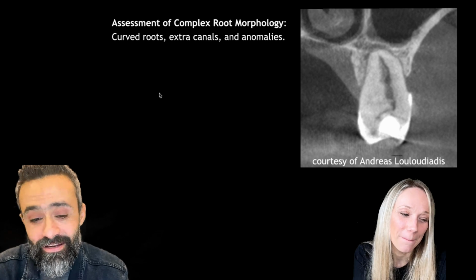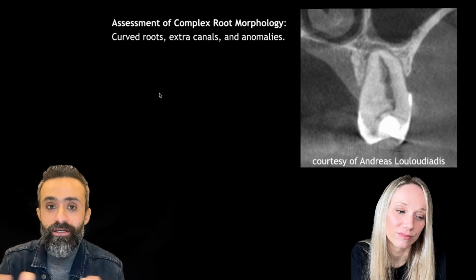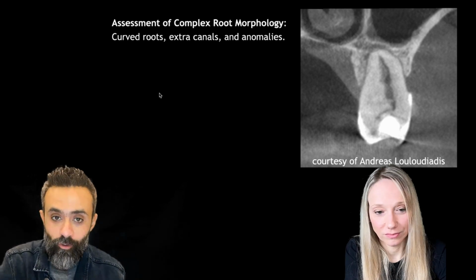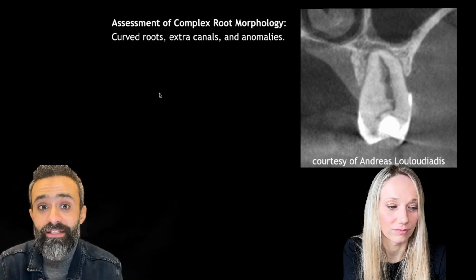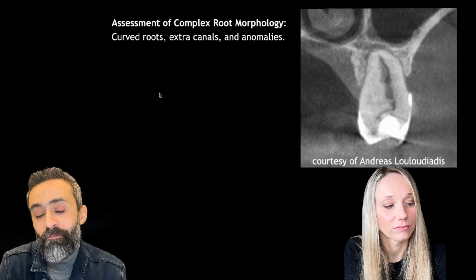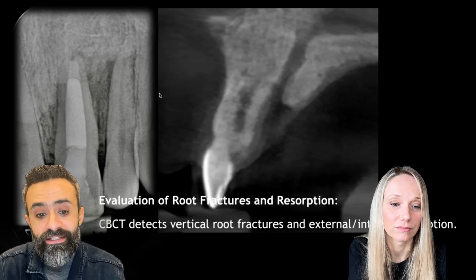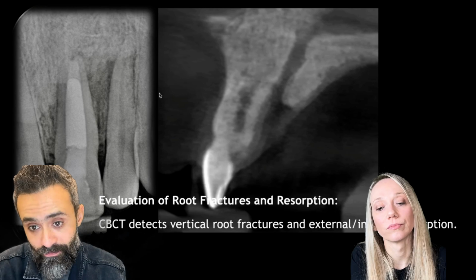Yes, exactly, and that's why we always say to our colleagues, in lectures or congresses, that CBCT is a minimally invasive tool for discovering the anatomy just before, as you said, placing even the rubber dam. So sometimes we have some teeth that cannot be saved, like those with vertically fractured roots. Our CBCT are indicated for those cases.